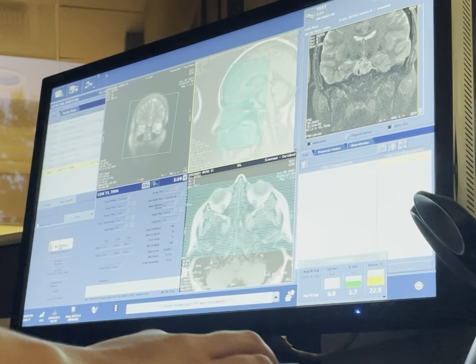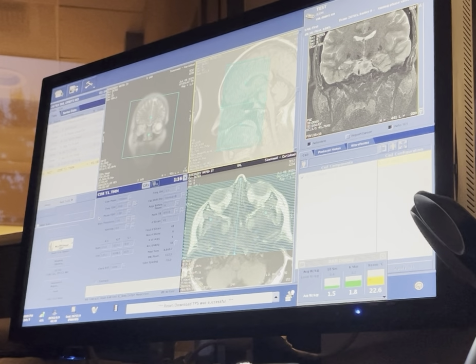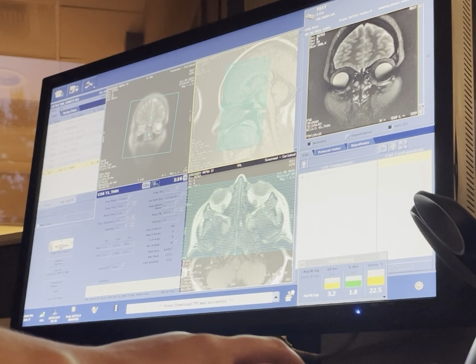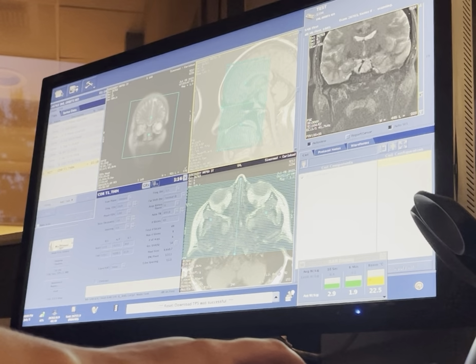By the way, that error up there, it says DVI1, so I think the DVI port has a loose connection with little screws that you screw in. I don't know where that is. I think it's in the back of the monitor. There's a column that's hollow with a bunch of wires in it. I think it might have just gotten jostled, maybe somebody moved the screen. I don't want to touch it.